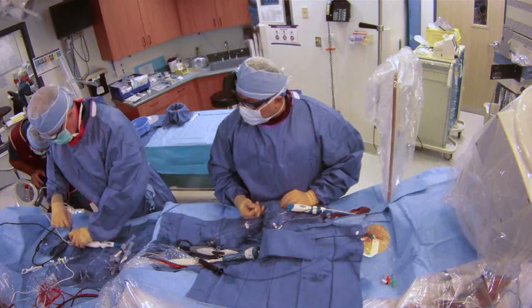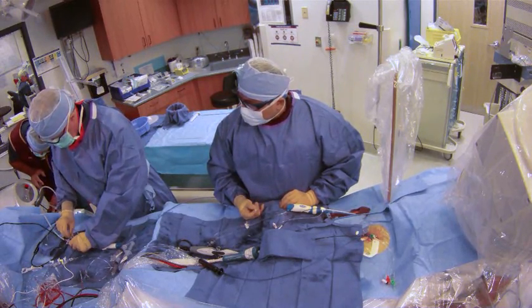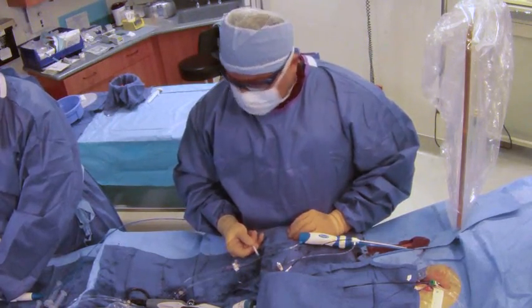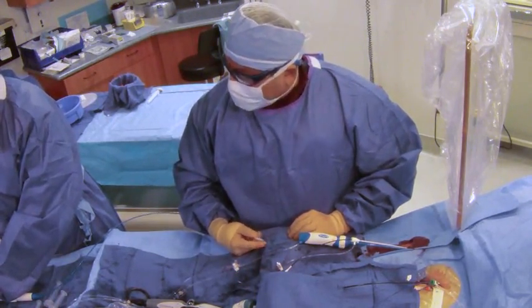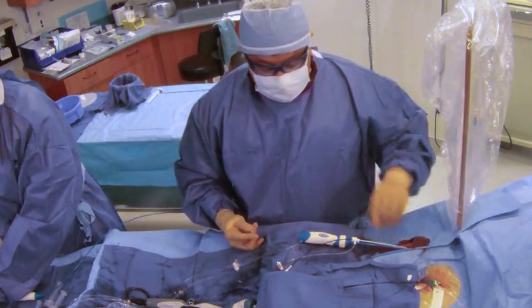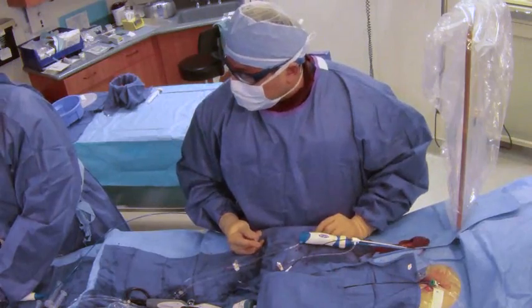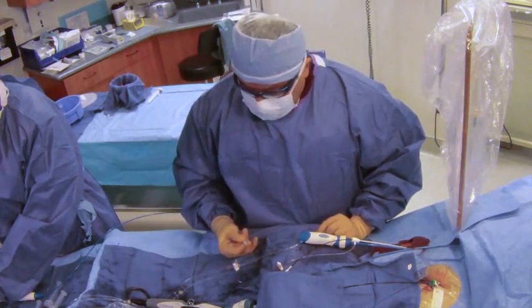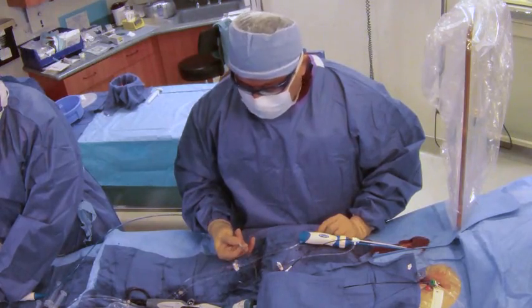We have back-loaded the wire, and again we want to flush out any air in the system well. We have chosen to use a manifold. This is actually where the interventional lab staff are very knowledgeable — getting all the air bubbles out, working with the manifold, and flushing out everything well.